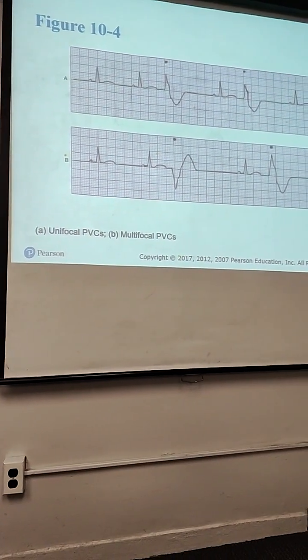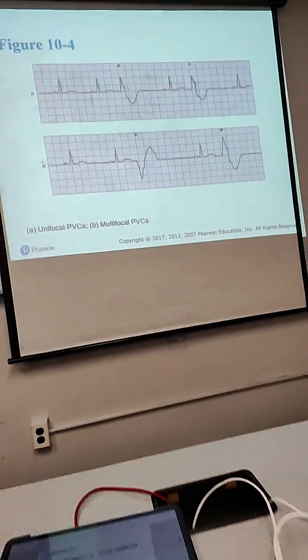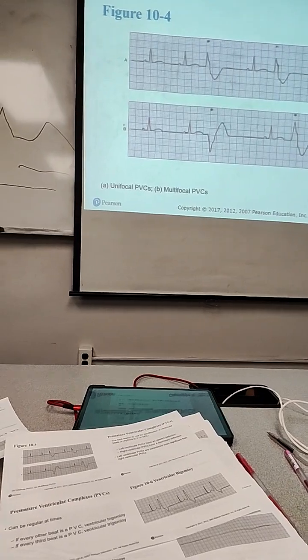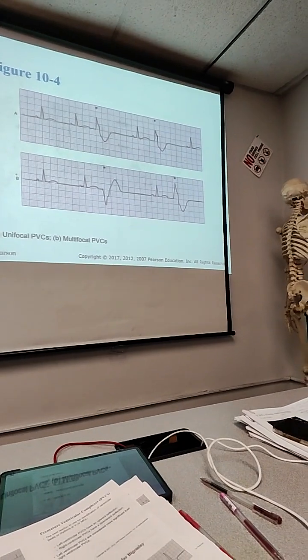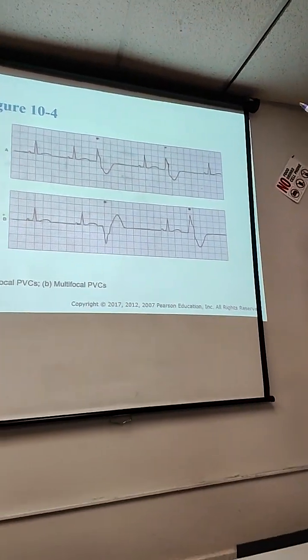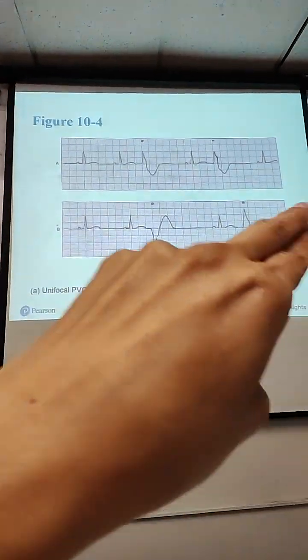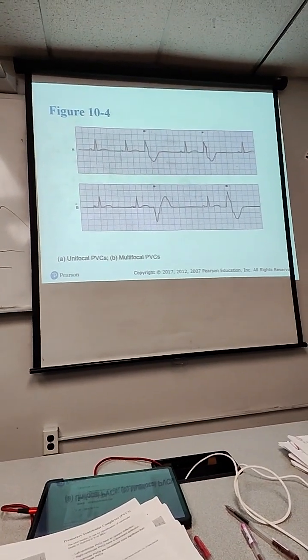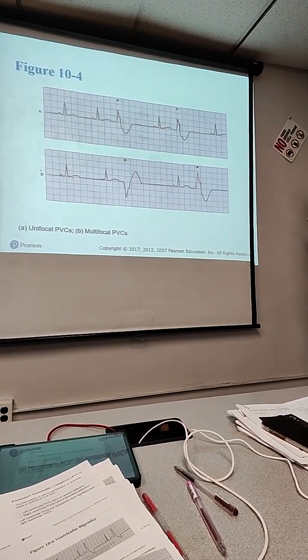There is a huge difference there. The QRS is wider? Okay, no. One, two, three. No, wrong direction. No, it is so obvious. You don't even need to count anything. It's easy to see it.